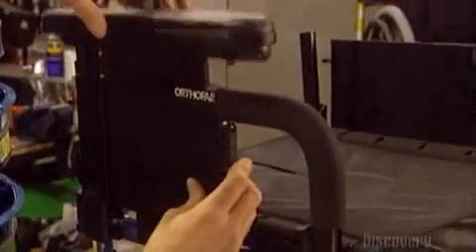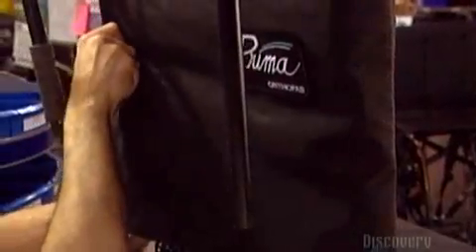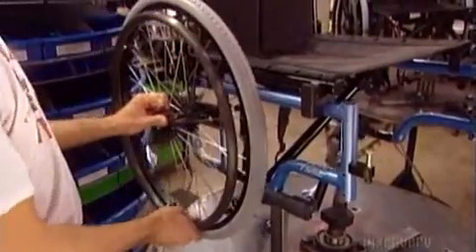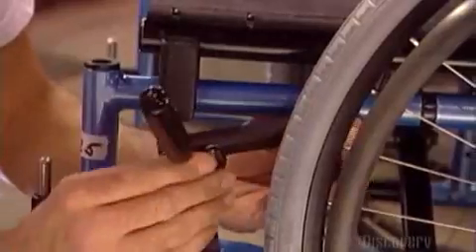You can adjust the armrest height from 20 to 28 centimeters and the tension in the backrest with 3 Velcro straps. The backrest is made of nylon and comes in 9 different heights. Workers insert the wheel axle into the frame, adjusting it to fit with the optional features of the chair, such as a particular style of armrest. The axle has a quick release so you can remove the wheel in seconds.